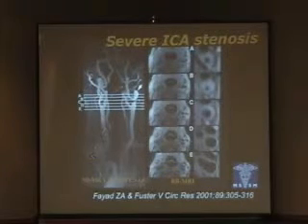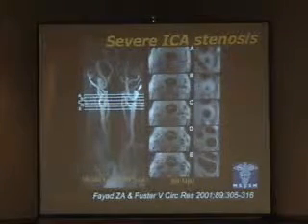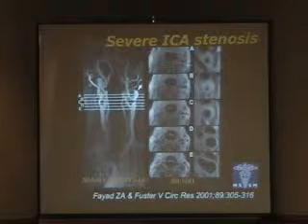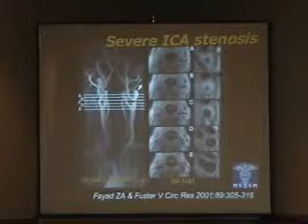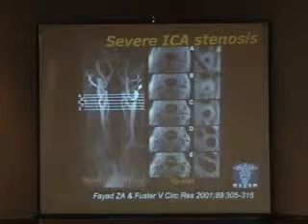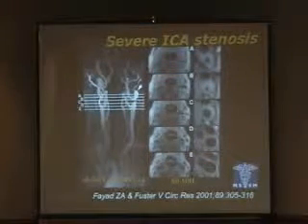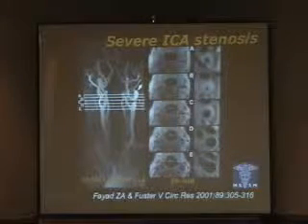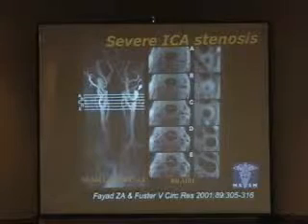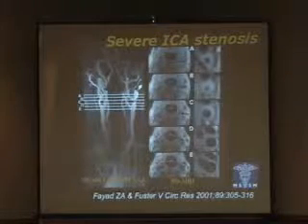You can get the percent stenosis very accurately, but on top of that you can add the vessel wall imaging, where you can look specifically at the wall itself. Combining these two provides a lot of information, especially in the carotid, where stenosis is obviously very important, but you can also evaluate the vessel wall itself.